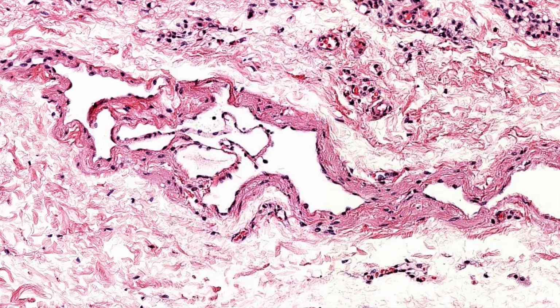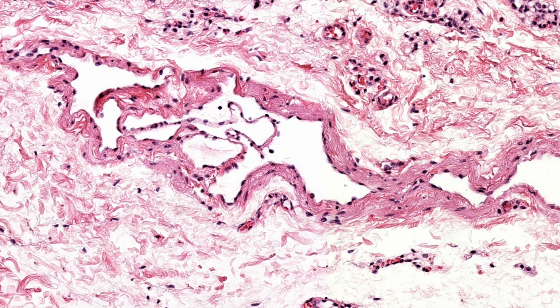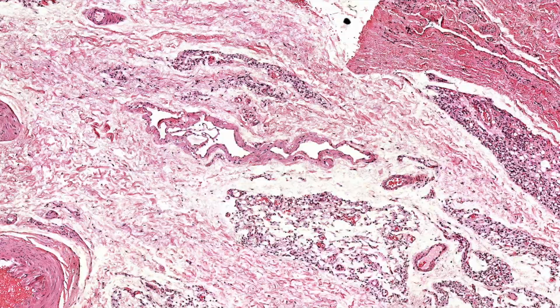Oh, and one more vessel, a cute little incidental finding. Look at that. This is a little, probably thin-walled vein, although maybe it could be a lymphatic. I cannot reliably tell them apart. But either way, it's a valve. Sometimes you can perfectly see the opening between the two leaflets, but that's a valve in a small venule or lymphatic channel.